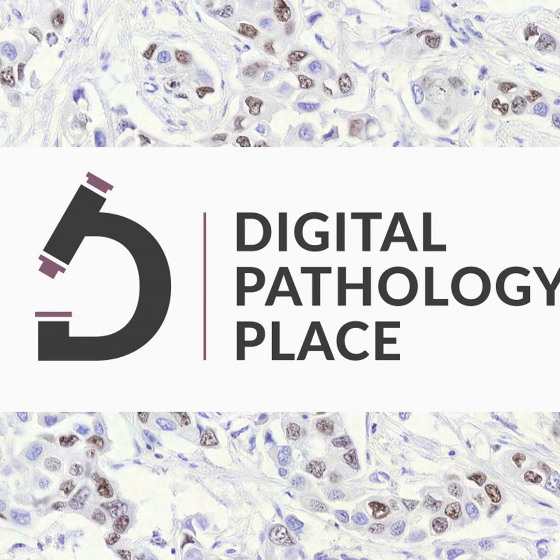Quantitative image analysis harnesses the power of digital pathology by providing a more objective, accurate, and reproducible method of analyzing tissue samples. With advanced algorithms, digital pathology software can quantify various morphological characteristics of tissue, such as the number, size, and shape of cells, their spatial relationships, and staining intensity. These data can then be used to draw conclusions about disease processes, patient prognosis, or treatment response.